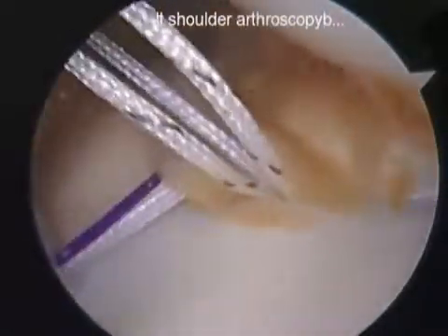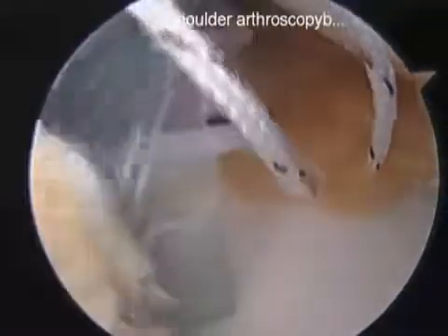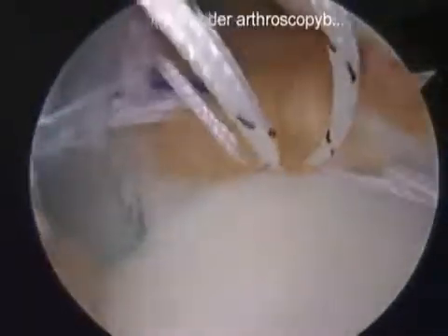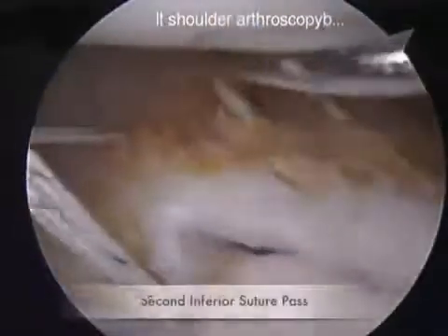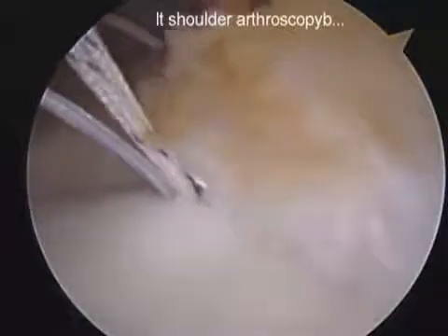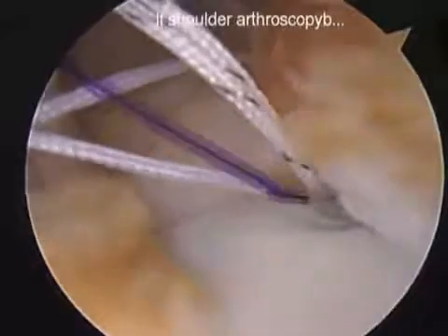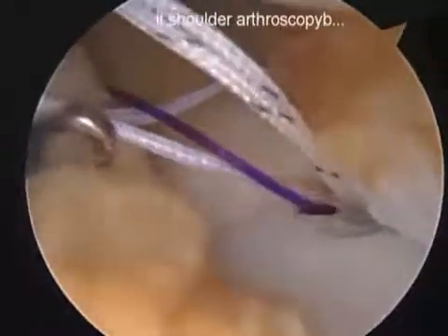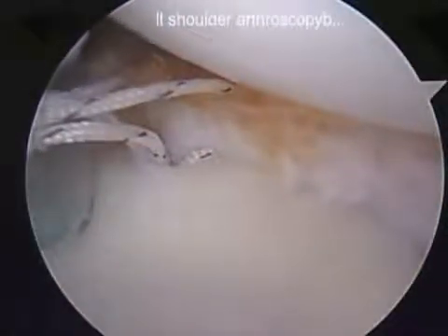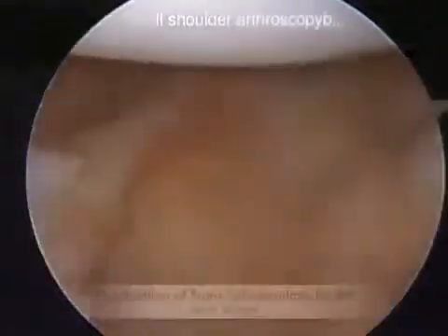A standard shuttling technique with a PDS suture is used to pass the first suture back through the capsule. The second suture pass is taken from the anterior-inferior portal. This pass will continue to reduce the anterior-inferior capsule and shift the tissue superiorly and laterally. Here you see the two stitches passed in a simple fashion. These are left untied so as not to impede the mobilization of the bony fragment.